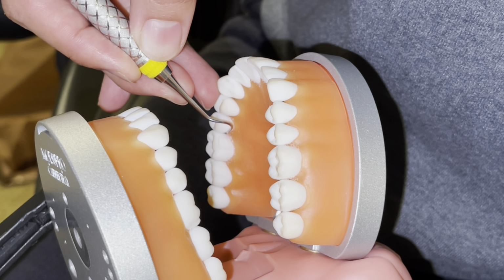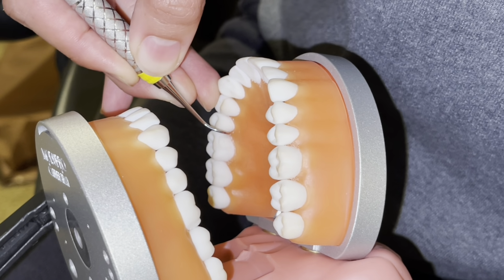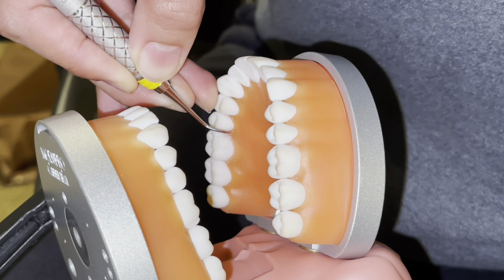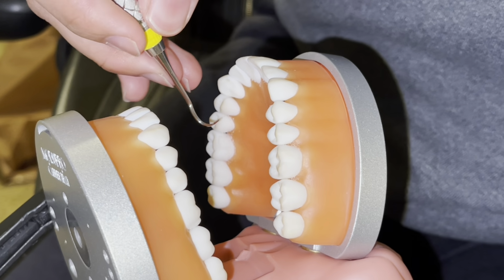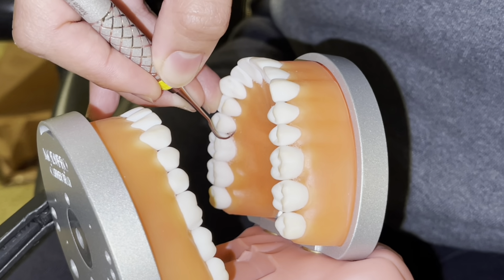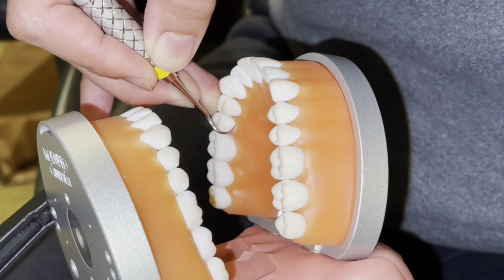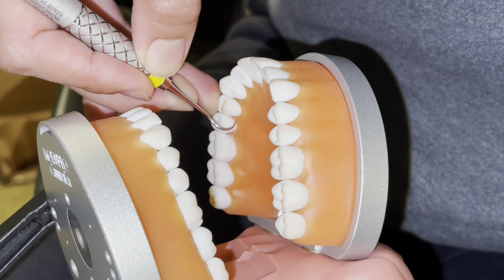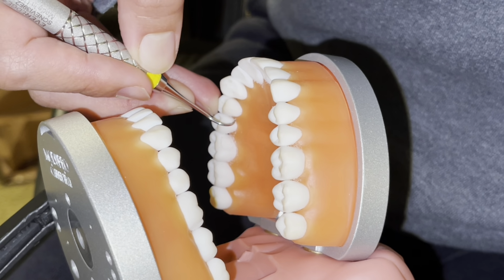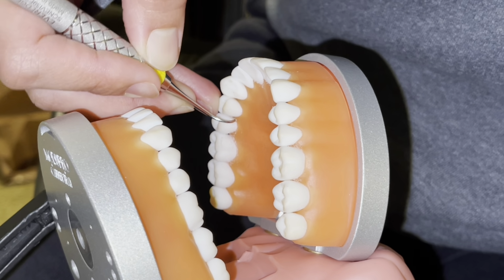Side to side, side to side. Interproximal, go up, down. Turn your instrument halfway and walk towards the mesial. And up, down, pivot, roll, side to side, down, pivot, roll. In the interproximal, go up, down.